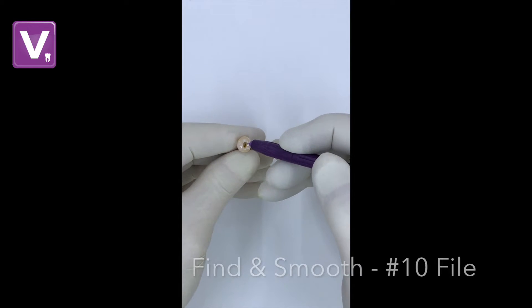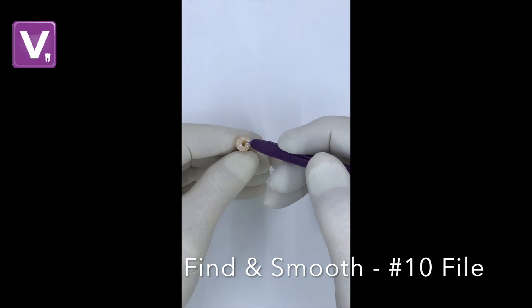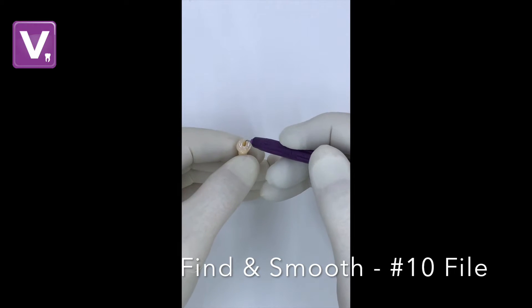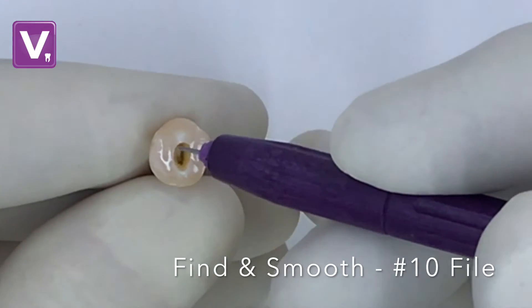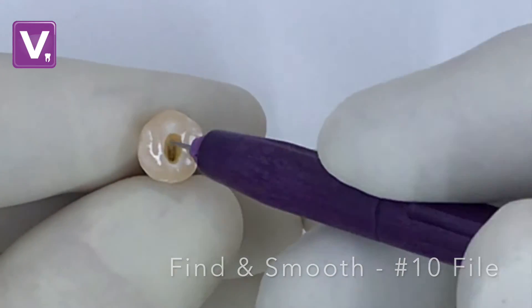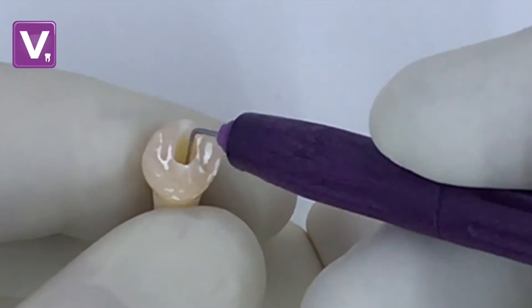After access preparation into the pulp chamber, finding and smoothing the canals is the next step. The endo handle finds canals easily, and the simple controlled up-down file movement creates space, smooths out rough walls, and fragments pulp tissue.